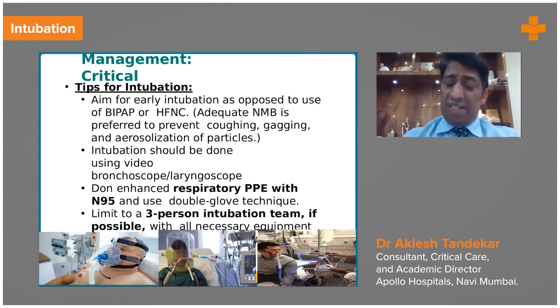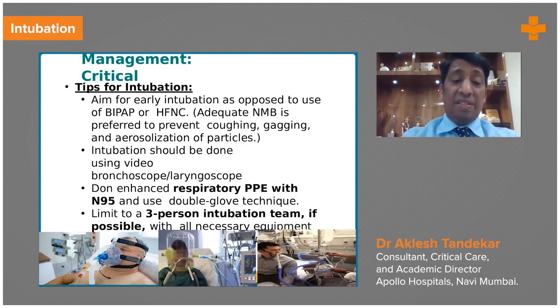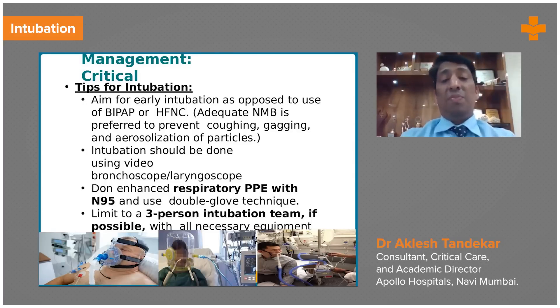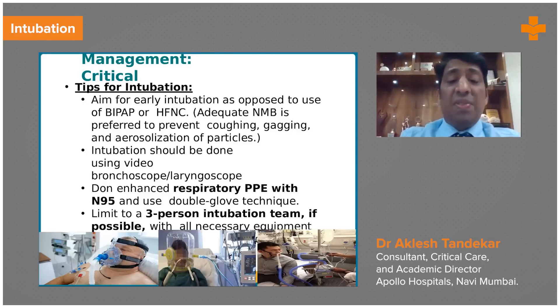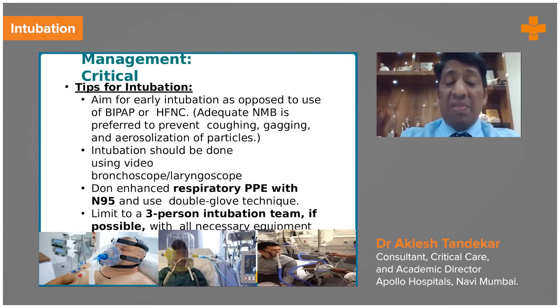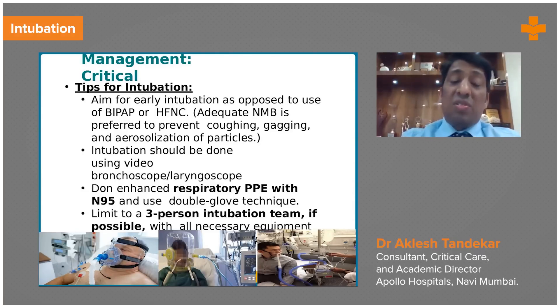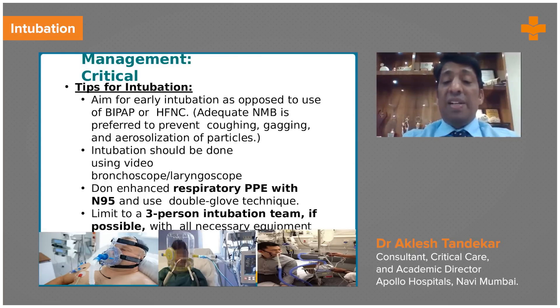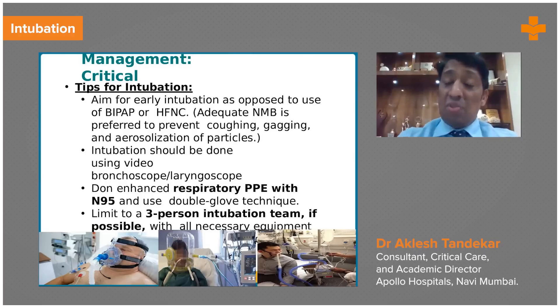We should have a team of doctors who can help. These are the different devices — this is the BiPAP device used to give oxygen support. This is the helmet mask; patient compliance is very important because the patient may feel claustrophobic inside the helmet, but it will help prevent aerosol spread to healthcare workers. This is how the high flow nasal oxygen device provides oxygen via nasal prongs at a higher rate and higher flow values.